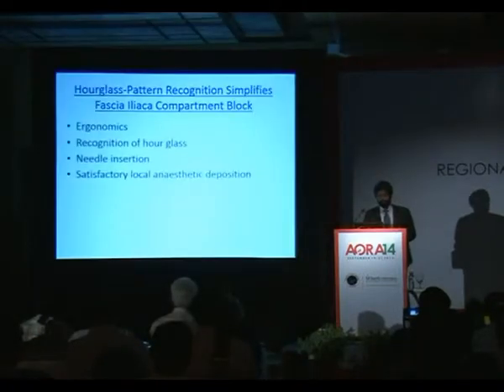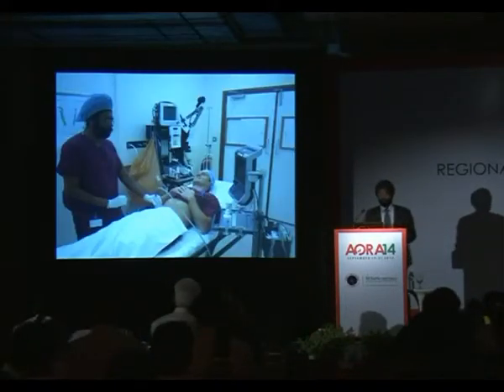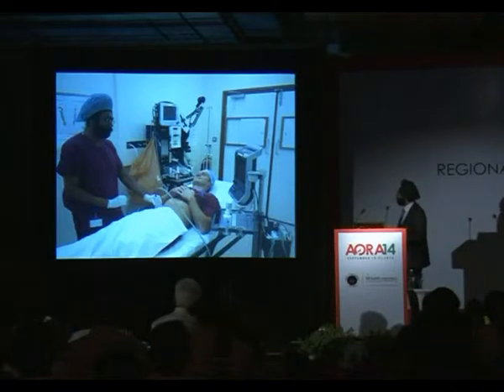So I'm going to discuss this block under four headings. First of all, I'll talk about ergonomics. Then we'll talk about how to recognize this hourglass, then how to introduce our needle, and then what is a safe or a satisfactory deposition of local anesthetic. So that's my block room.